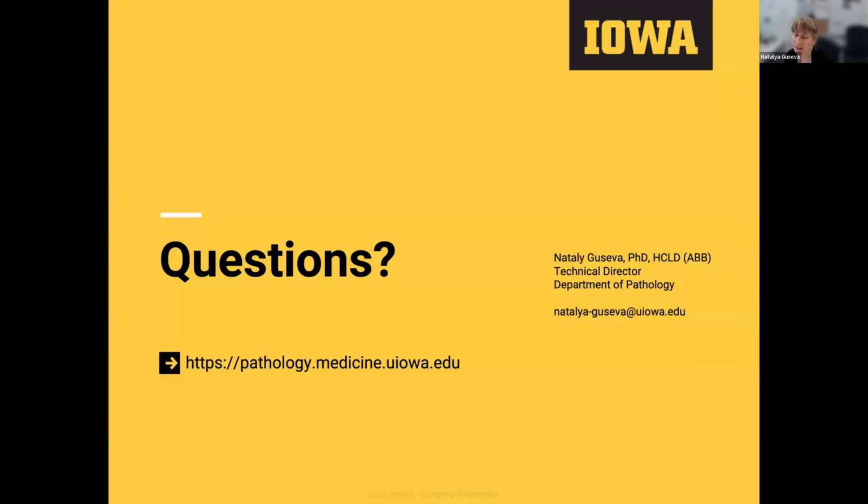Saying this, using this big panel now, we sometimes find very interesting, weird stuff, which has a targeted gene related to the malignancy we tested for, but on the other side, it's a very unknown partner. For example, non-coding RNAs, which are not very well known, and we have to confirm them. Of course, they usually confirm by RT-PCR and Sanger, and then we have to make sense out of this. What does this really mean? Some literature on this exists, saying that it could play a role in the development of these malignancies. And we are working on investigating this in our next research studies.